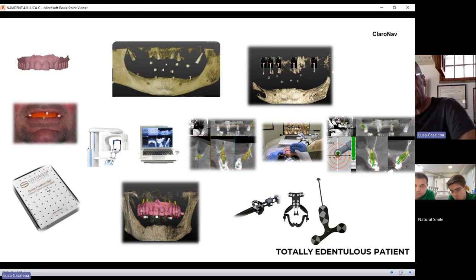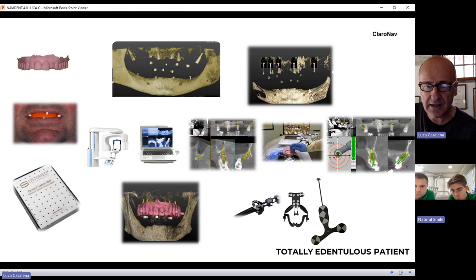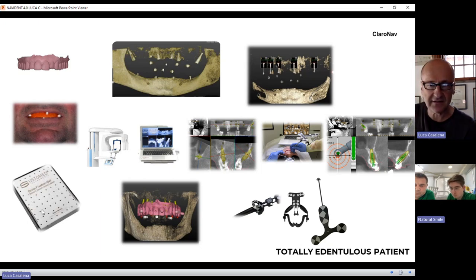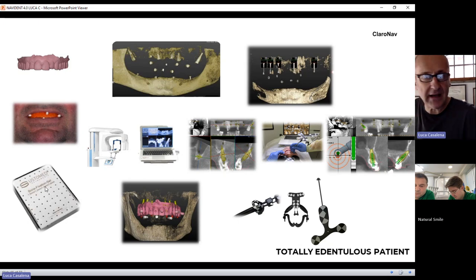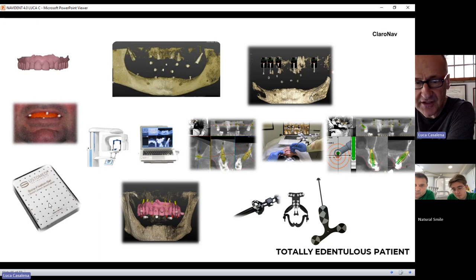Secondly, we suggest using the Eustomed kit. It's not disposable — once the procedure is over, you can unscrew the mini screws, cleanse and sterilize them, and use them again for the next patient. The kit will last until you lose all the screws, which is practically eternal. You don't need to buy one kit per patient — just one kit, properly managed. The kit includes a screwdriver and a couple of pilot drills for working with the mini screws.